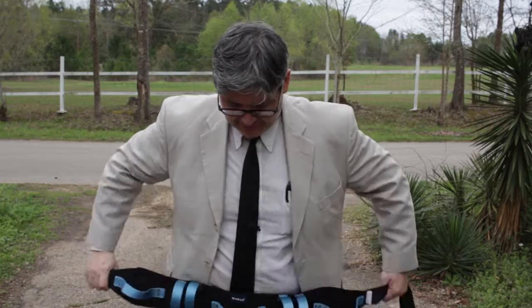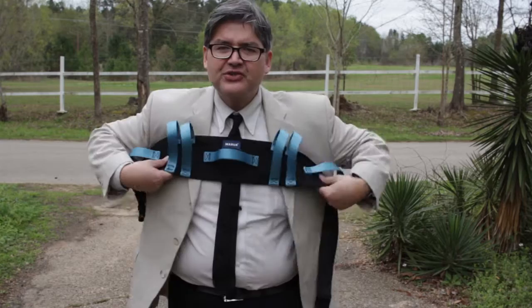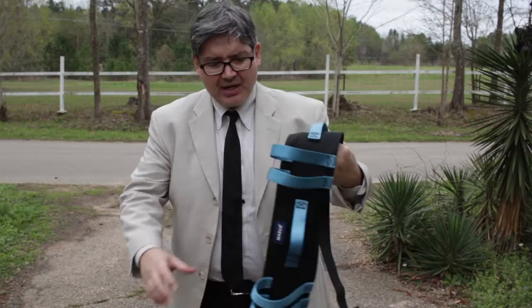You basically just put it around your waist, and you can have one person, two people, or three people help lift you up from the ground, help you sit down in a chair, help you get up or sit down on your bed. If for some reason you can't put it around your waist because of some other health issues, you can put it under the arms as well, and as you can see that would work quite easily.